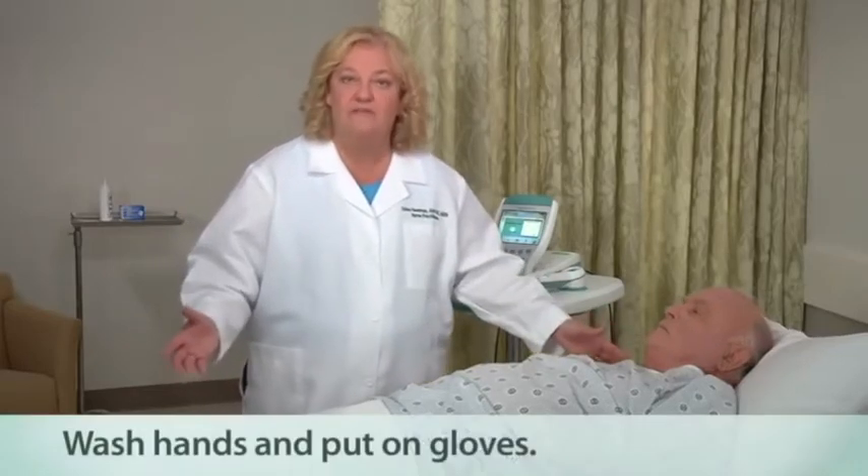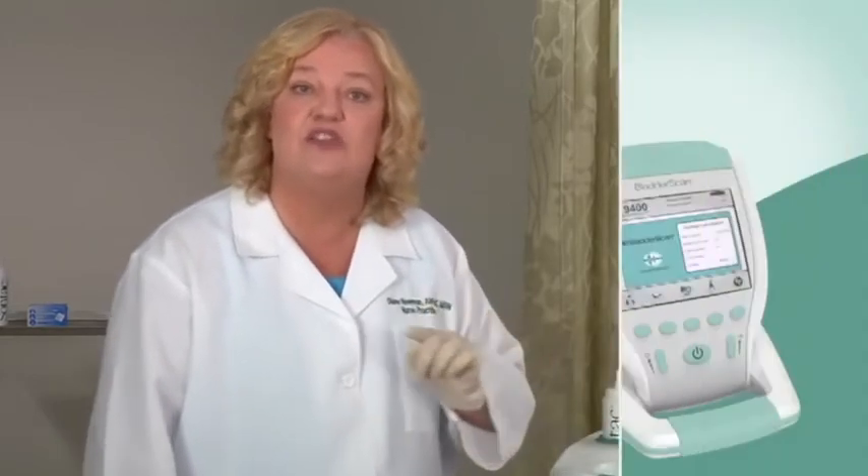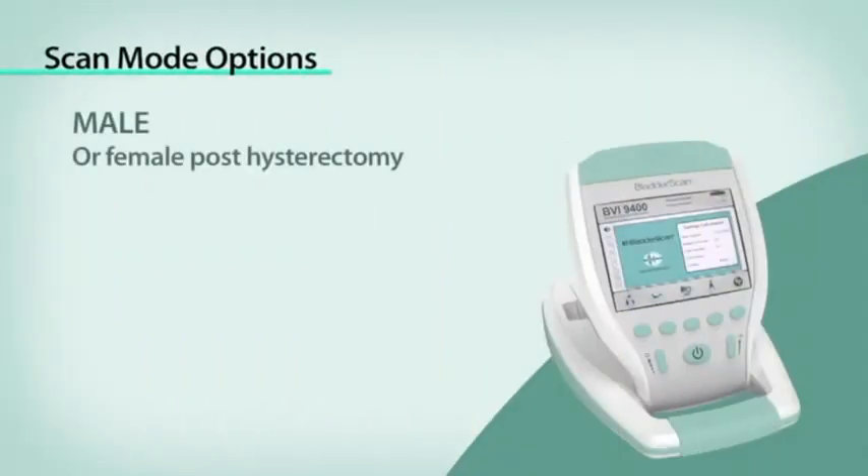Explain to the patient the Bladder Scan procedure and the reason for measuring bladder volume. Have the patient lie in the supine position, flat, with head elevated on a pillow. Turn on the Bladder Scan by pressing the on-off button, which is right here. The Bladder Scan BVI9400 is designed to scan in three specific modes: male patient, female patient, and small child.